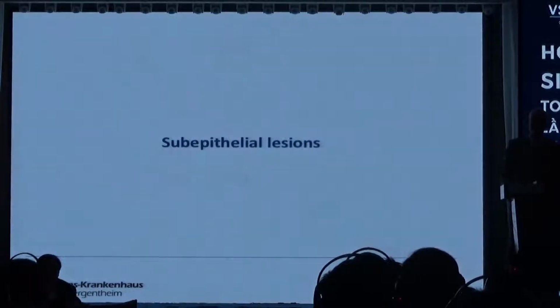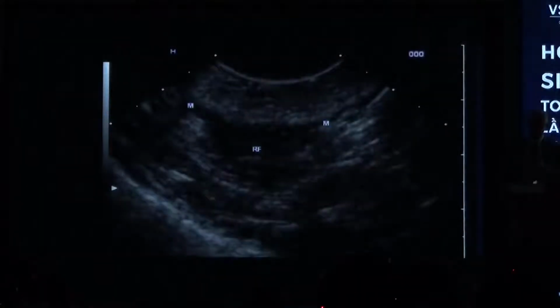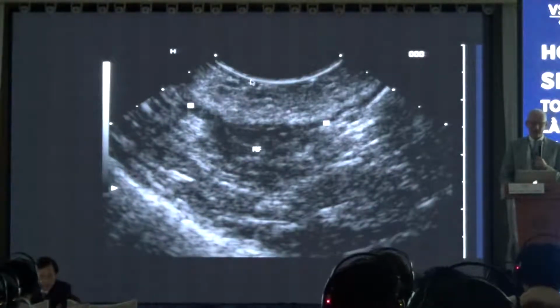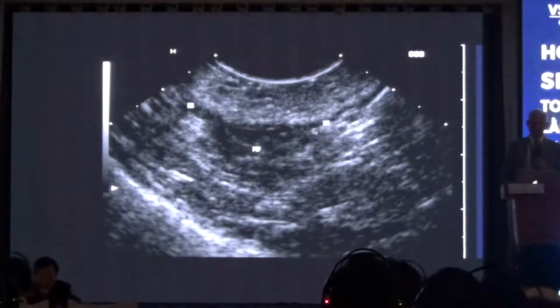Subepithelial lesions within the intestinal wall might give us a little bit better delineation.